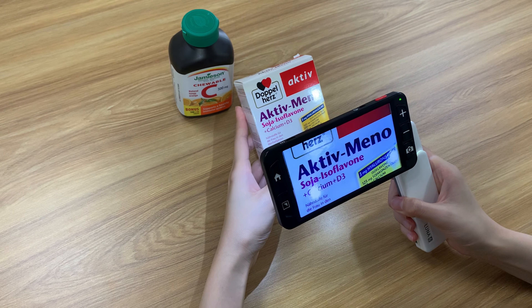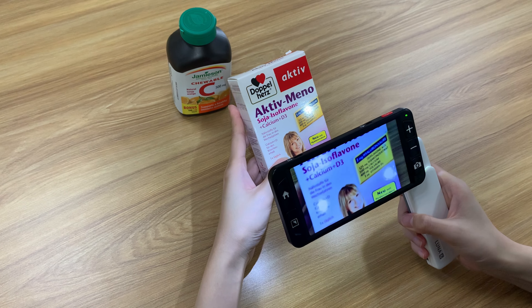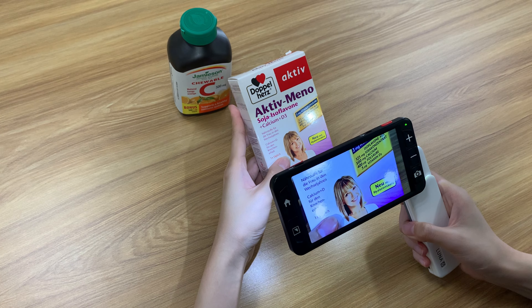With similar basic functions, what's the biggest difference between Zoomax Luna 6 and Luna 8? The most obvious answer is their size. Luna 6 has a smaller size and a comfortable built-in handle, making it more suitable for outdoor use. Luna 6 plays a crucial role in checking labels in the supermarket for the visually impaired.